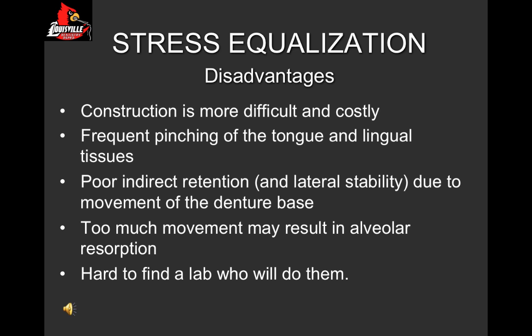This type of design also offered poor indirect retention and lateral stability due to the movement of that denture base very easily. Also, if you get too much movement in a denture base like this, it can result in alveolar resorption.